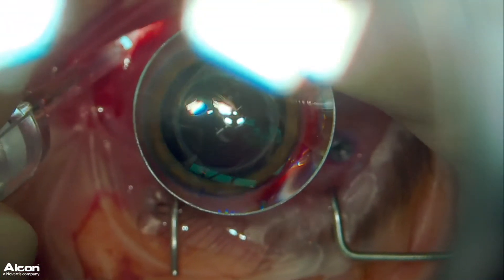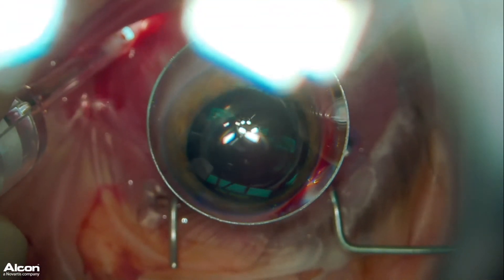This is a case that we did a few years back, and I wanted to highlight the fact that vitrectomy doesn't always have to be three-port.